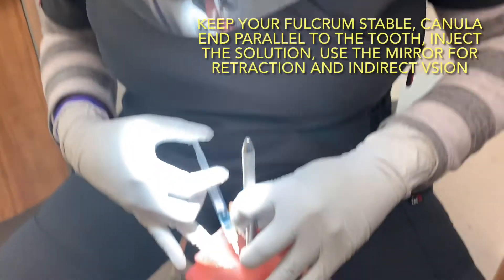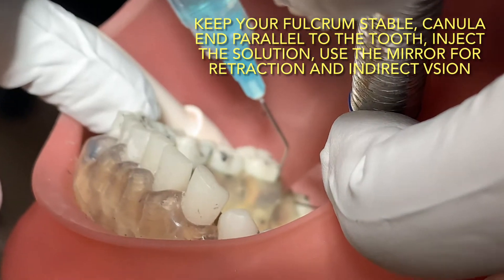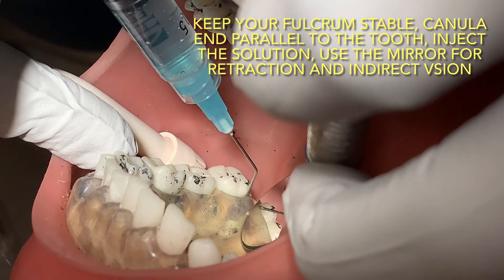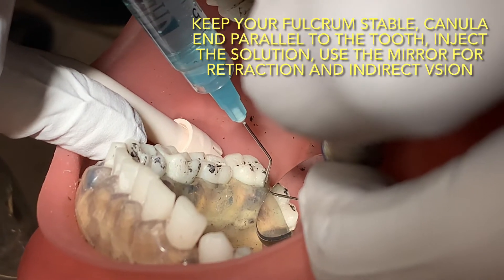I'm making two passes in each pocket: pocket one, pocket two, and pocket three.